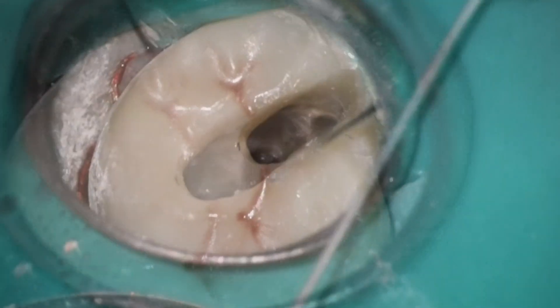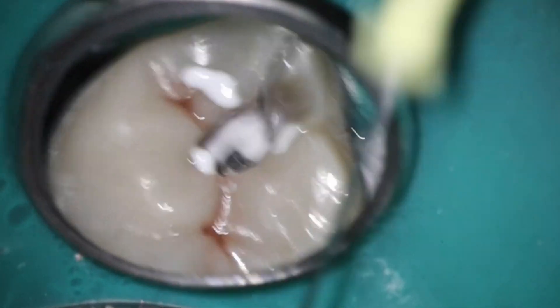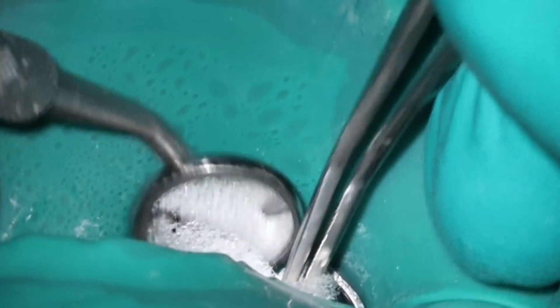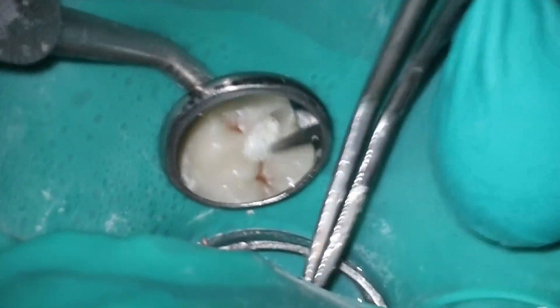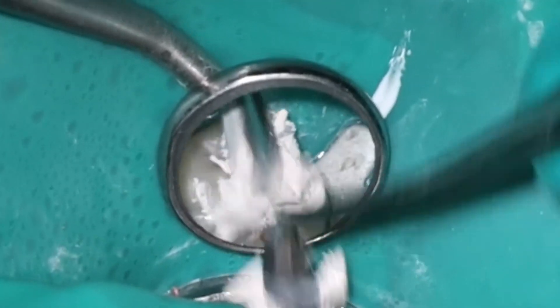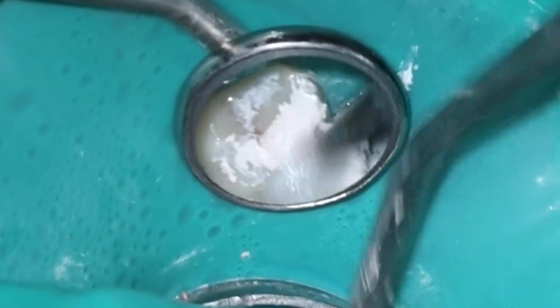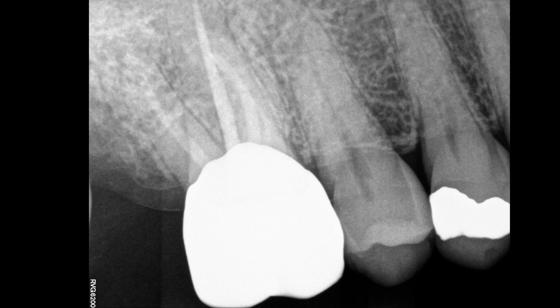Going to take a break — you'll be able to see and notice that they join. That is actually why I'm not too worried. A lot of times when those MB2s come in, they'll come in at almost a right angle and you won't be able to get the rotary file around there. If you find that you're getting stuck, calcium hydroxide also helps soften the teeth a little bit, making it sometimes easier to get around any calcified spots or ledges. So I'll put the calcium hydroxide in. I always start in the MB2 because as you saw, it filled up the MB1 — telling me that this is a type II canal system.